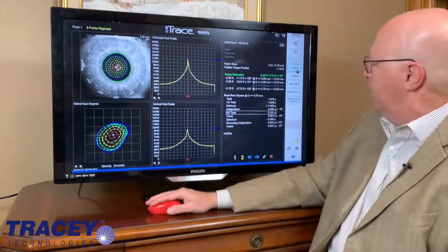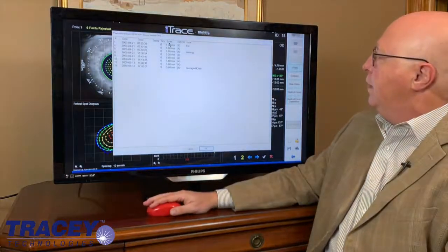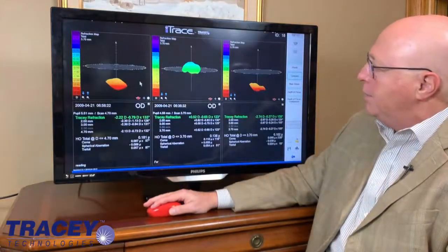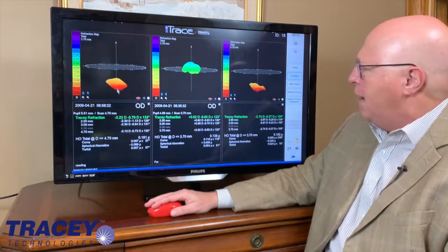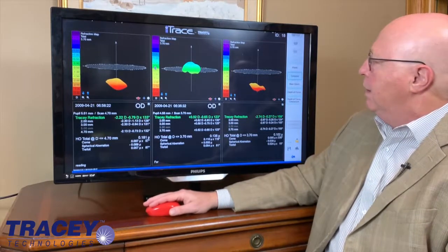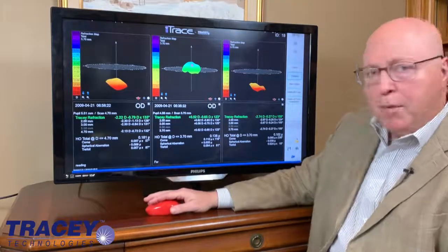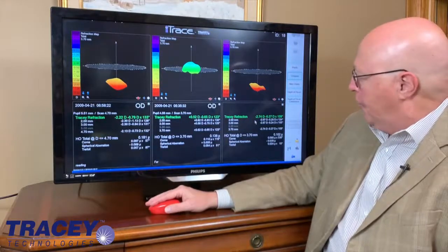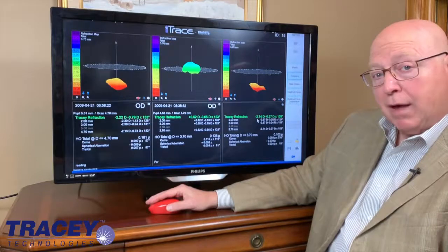Let's look at how we normally compare these two. When you compare this reading to far, you'll see a 3D representation: when the patient is reading they can get almost three to three and a half diopters, and when they're looking at distance there's the plano in the green, but they can actually get to about a plus one. So there's almost four diopters range of focus. But when you look at a straight subtraction of their refraction, it only says they get 2.75.